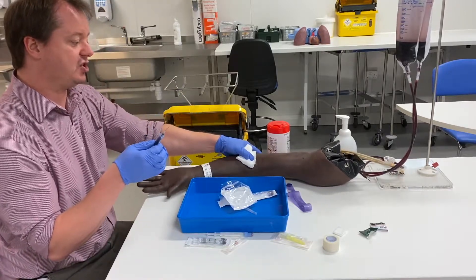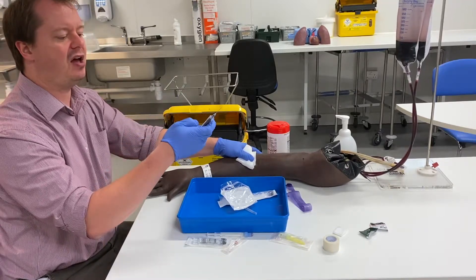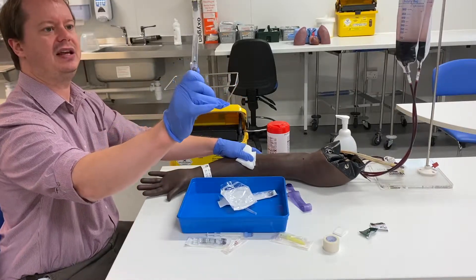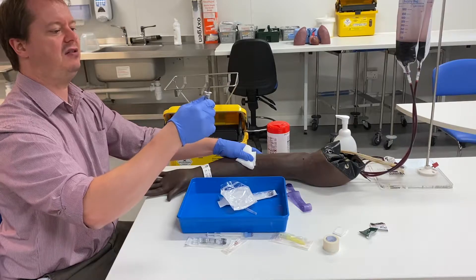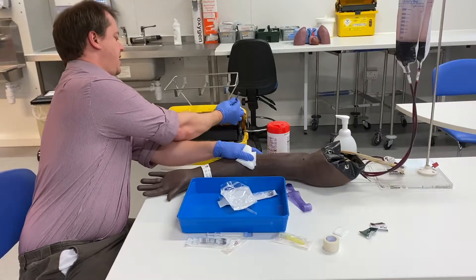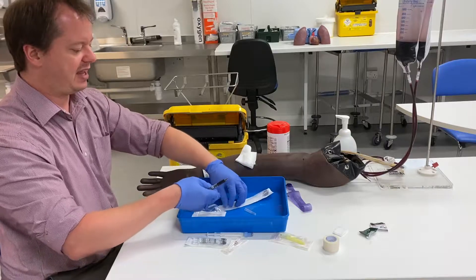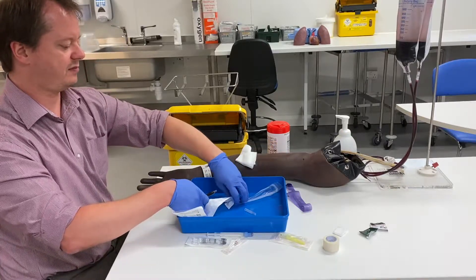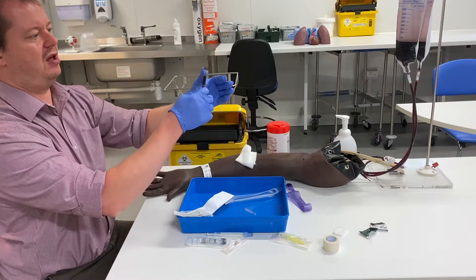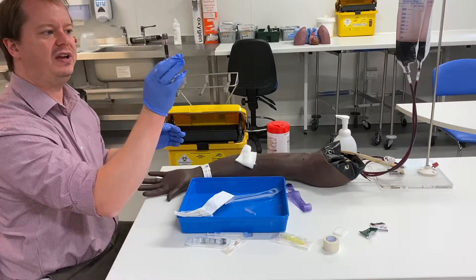You can get the patient to push down on the gauze, which is really handy. If they can't push down on it, you need to make the sharps safe one-handed — just by pushing the cover up until it clicks. Then you can take the syringe out of its cover, drop the cover into the sharps bin, and attach the cap onto the syringe. The cap goes onto the top — it's a little bit awkward to put on — but then you can very carefully just push some of the blood into the cap to pull the seal, and then you've got your venous blood gas.